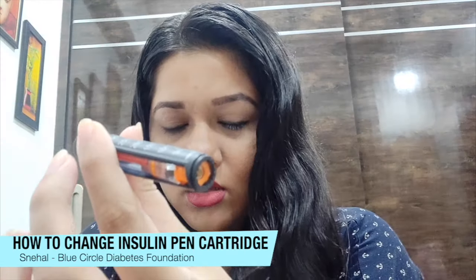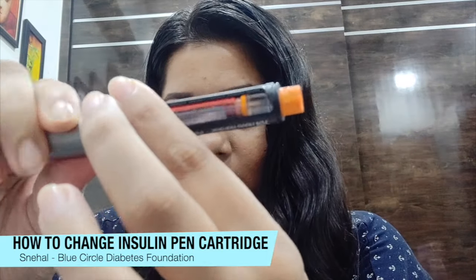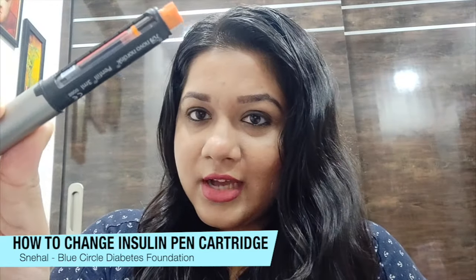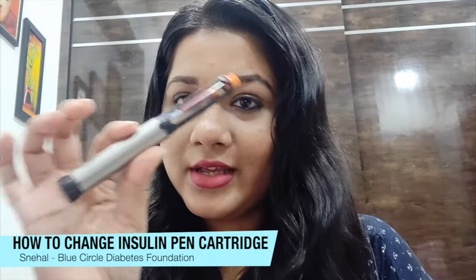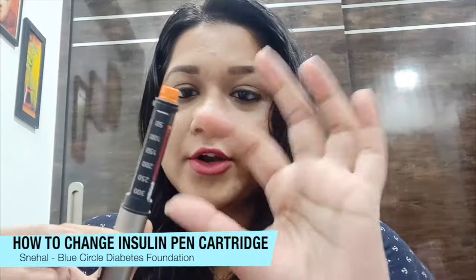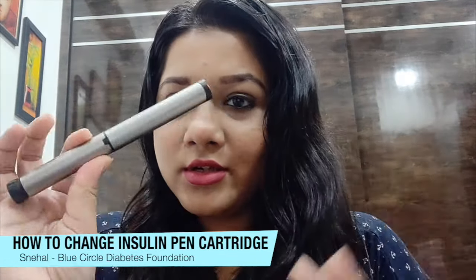Screw it back in and you will hear a click sound — that is when you know for sure that the top part is held securely in place. You don't want it to be loose or falling apart. Then you can just close it with the lid and your pen is ready to be used.